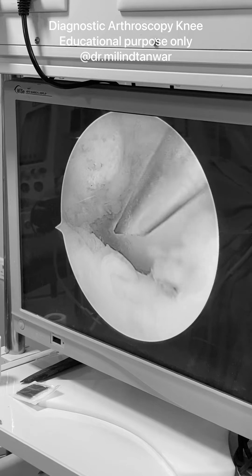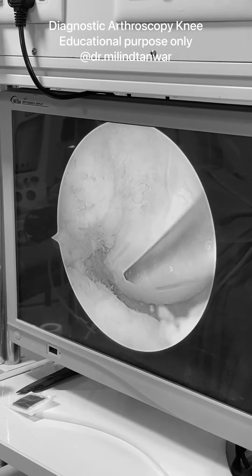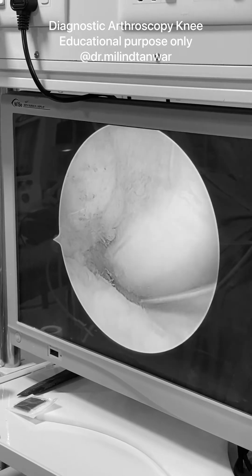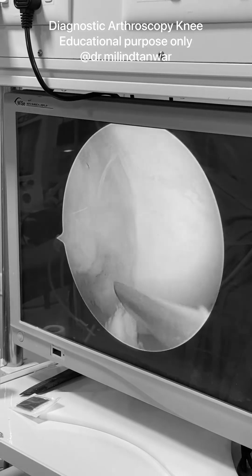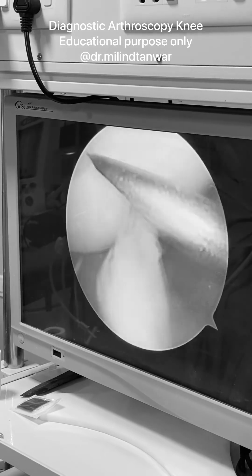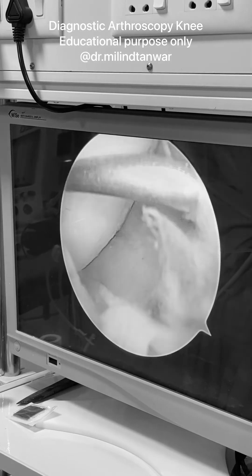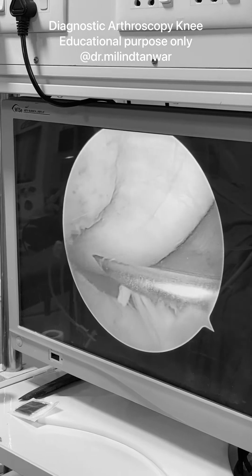The needle should go towards the posterior root part of the medial meniscus — this should be approachable. You can also use a spinal needle to do this job. Once we are confirmed that the needle is not through the meniscus, because it is just above the meniscus level, we can proceed in stages. You can visually confirm with a rotation that we are well above the meniscus and we are safe.